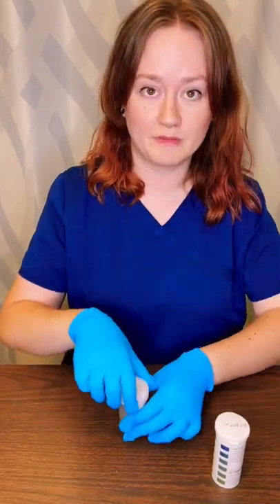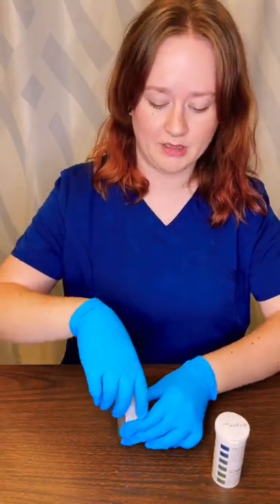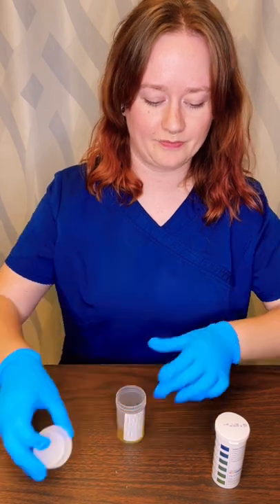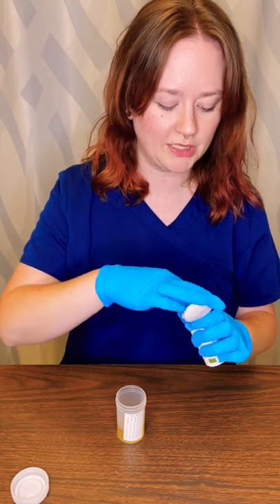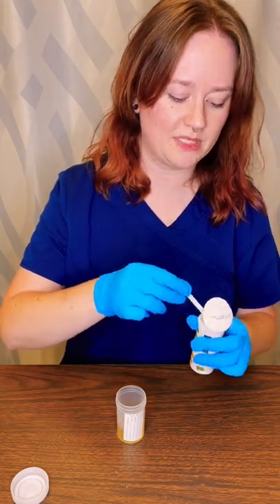Dipping urine, super straightforward. Got my urine, gonna open it up. I have test strips. This particular kind only does pH, but there are different types of dipsticks that measure different things like ketones.